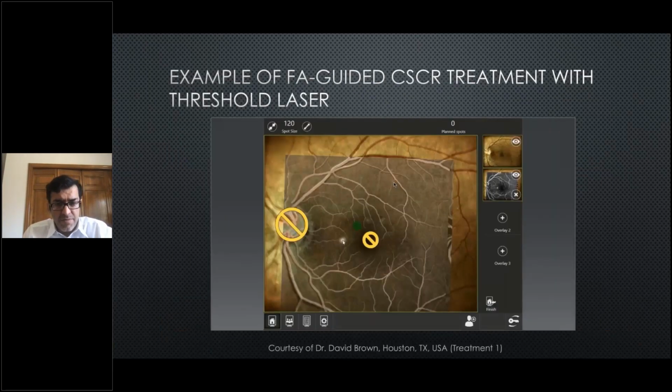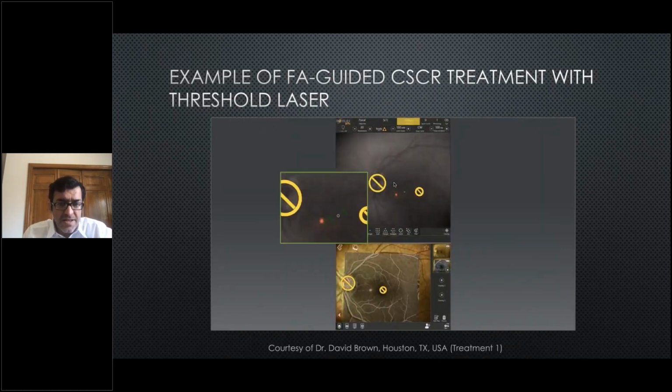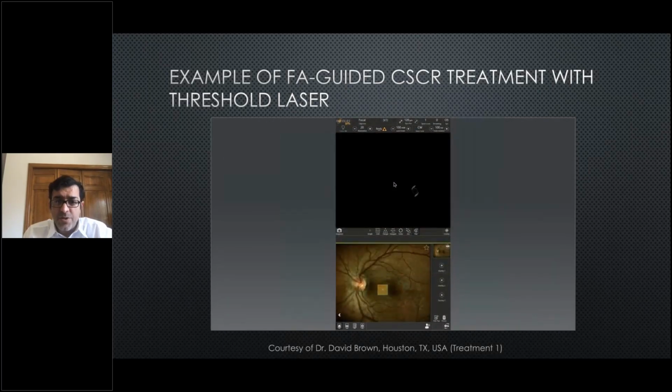This is a very nice video from Professor David Brown from Houston, where you can see that the Navilas laser is being performed, where he did the laser planning in the first step. And this time you can see that the contact lens is not placed on the eye. The patient is moving the eye, and with the help of eye tracking, you can do the laser.